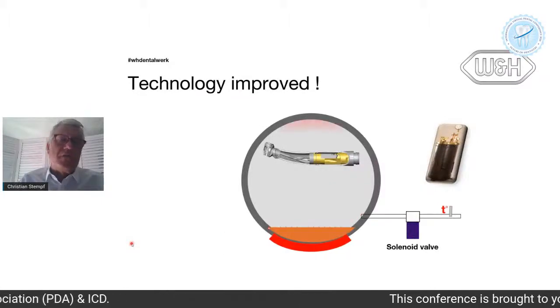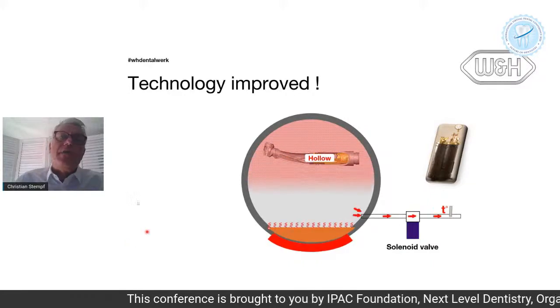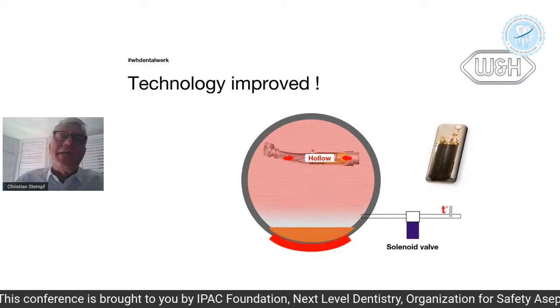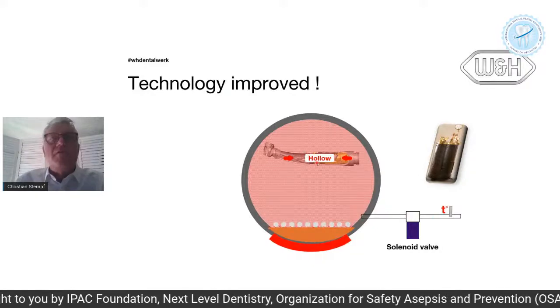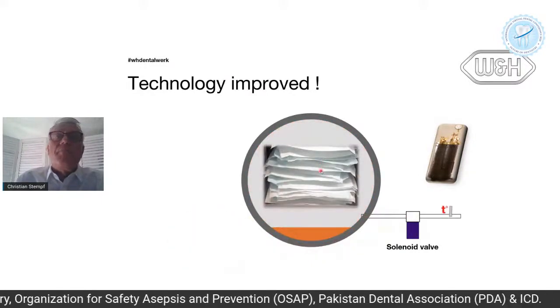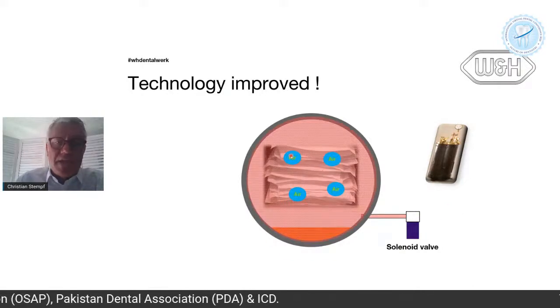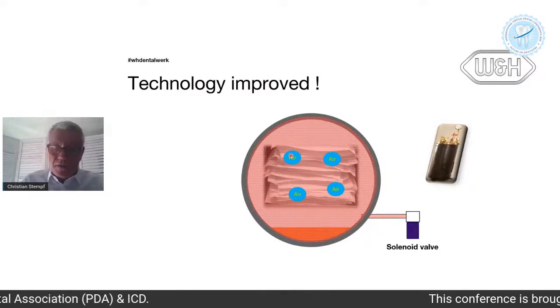Important is to have a good vacuum. If the autoclave does not pre-vacuum the chamber, you can have air bubbles trapped inside handpieces. And here inside, obviously, it's not going to be sterile. If you sterilize with air pockets inside, there is no steam. There is no sterilization.